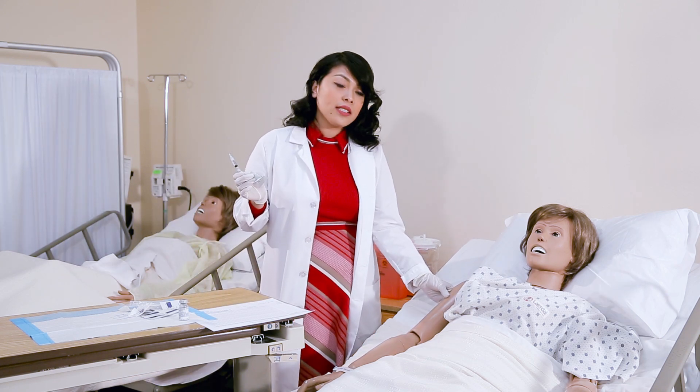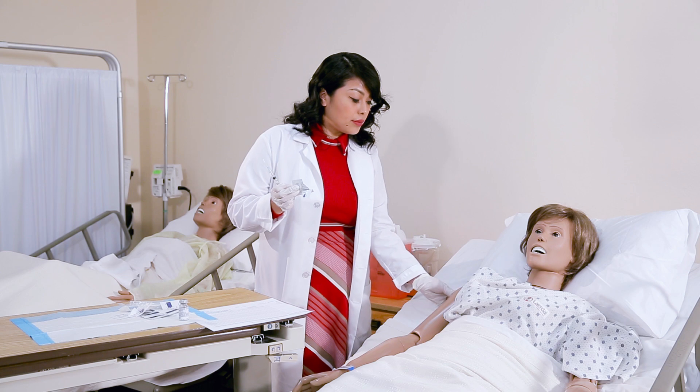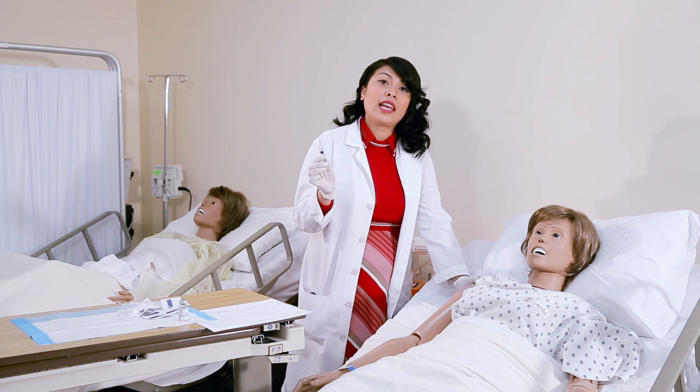Now you're going to go ahead and look at the site. This is the deltoid muscle, most commonly used for the IM injection. You are going to clean from inner to outer. Make sure the alcohol is dry so it doesn't seep into the skin.